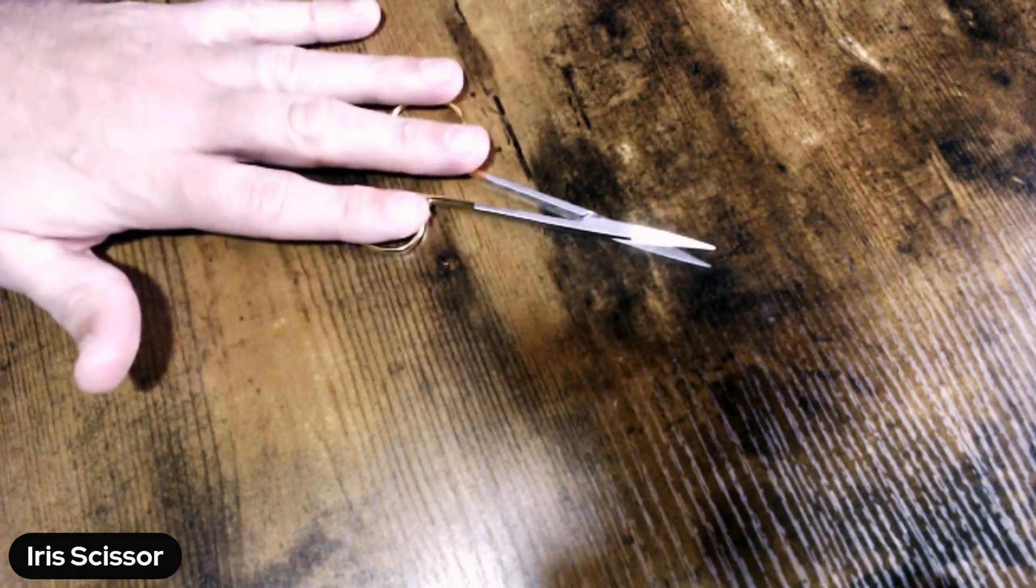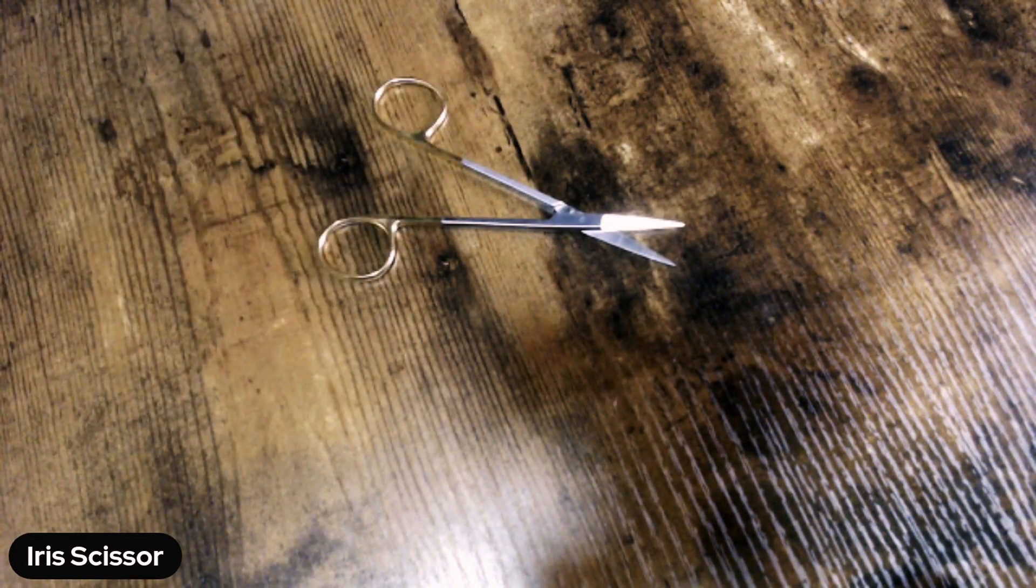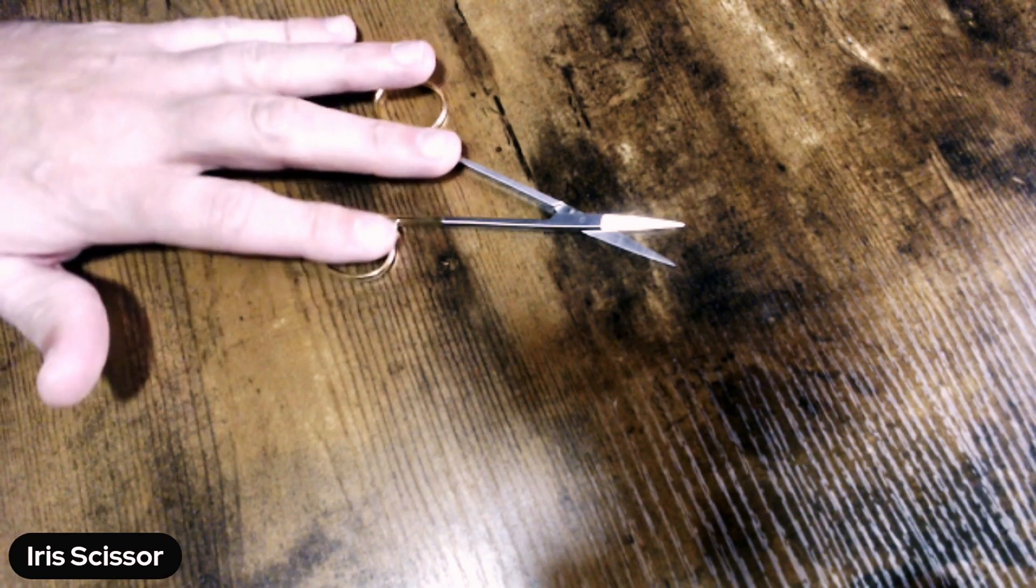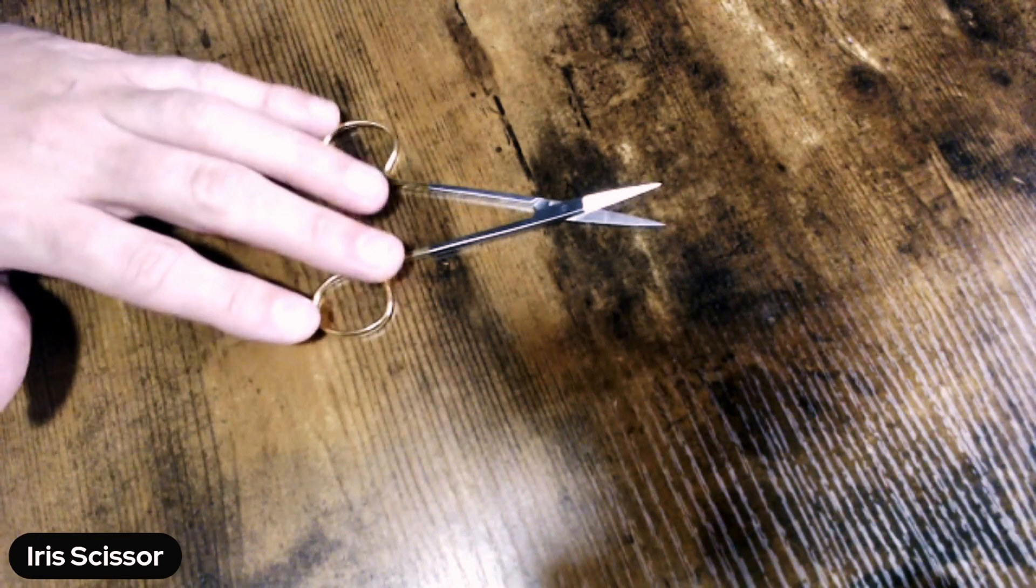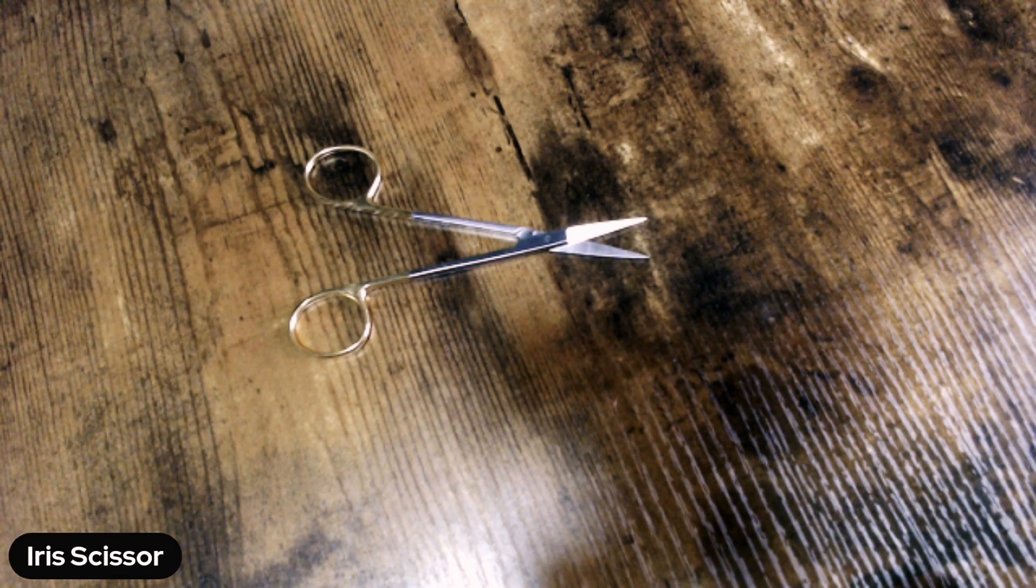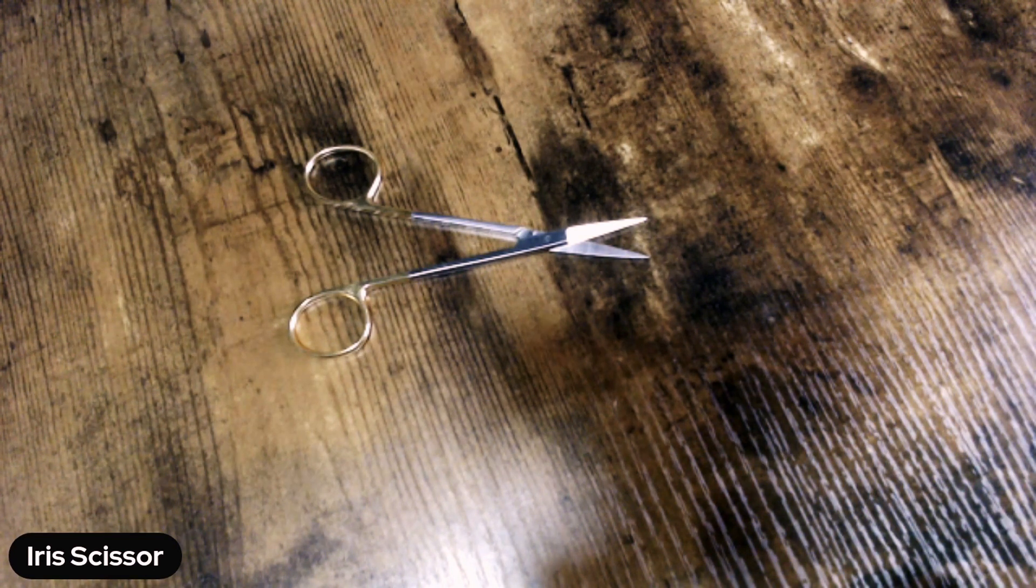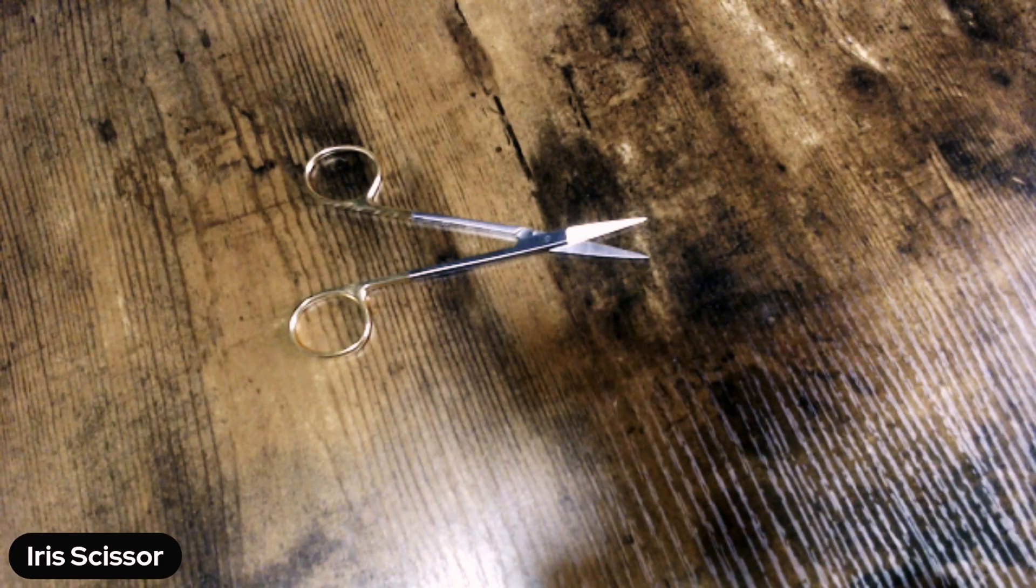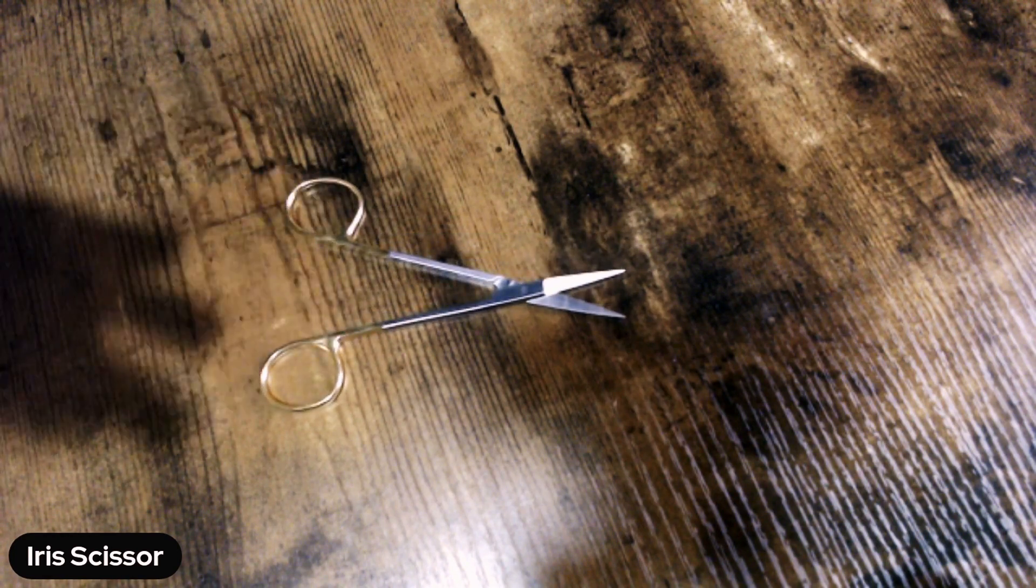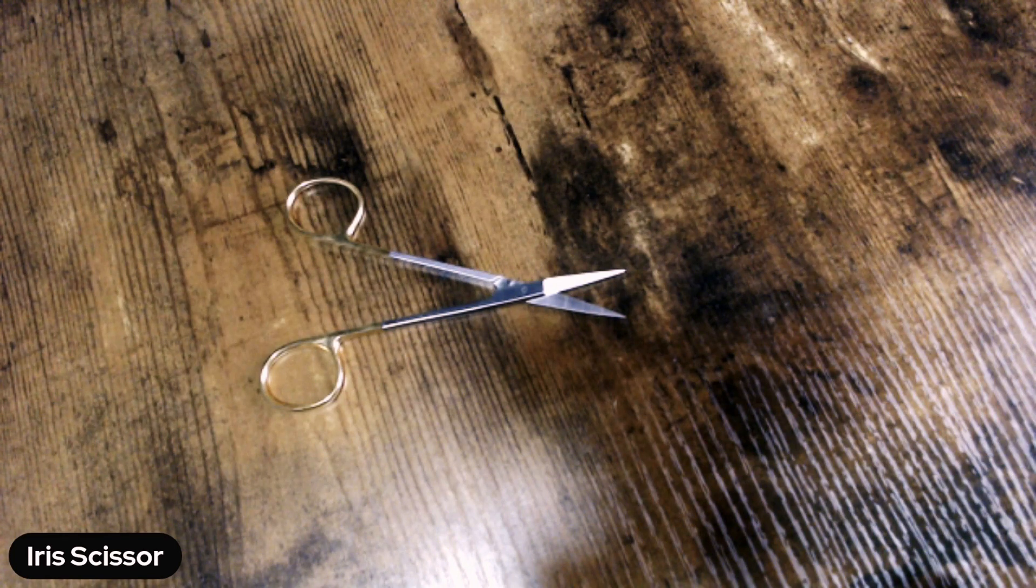But for scissors, you can and you should be testing the sharpness of your scissors with either yellow or red testing material, depending on the size of the scissor that you're testing. For some of the smaller scissors, such as this particular scissor, because it's not an orthopedic scissor, it's a good idea to be testing on that yellow testing material. Smaller scissors take yellow. As you go up the food chain for the scissor sizes, you move into traditionally the red testing material.